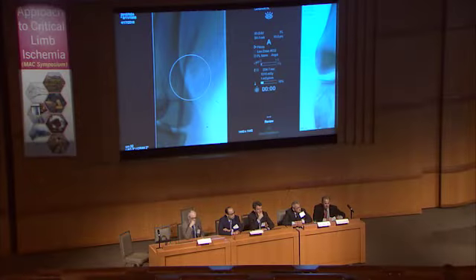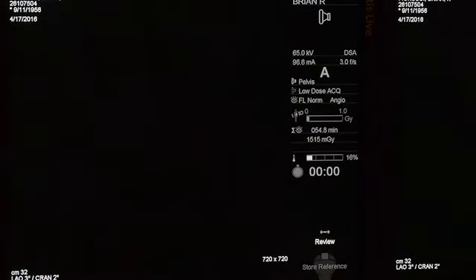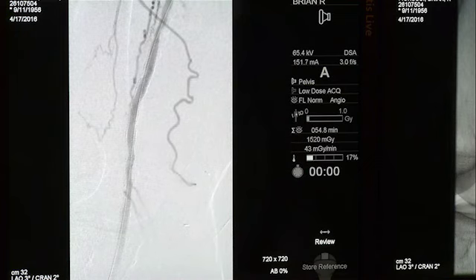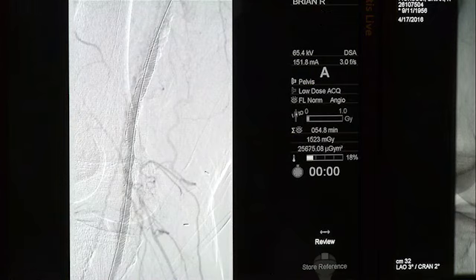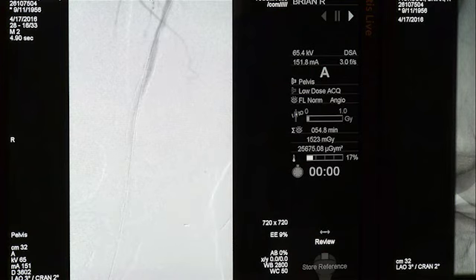So let me show you a picture of this for now, at least, just in case, so you can see what we did here so far. One second. Yeah, at the end we are already a little bit over time. But what you need to do before you extend with the second stent proximal, you need to post-dilate. Yes, absolutely. That's a very good point, Thomas.